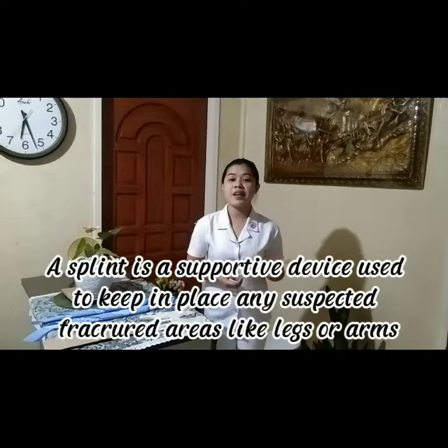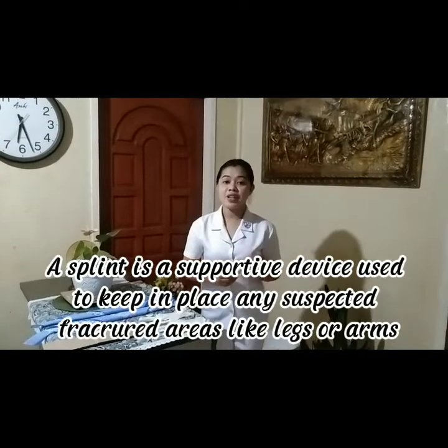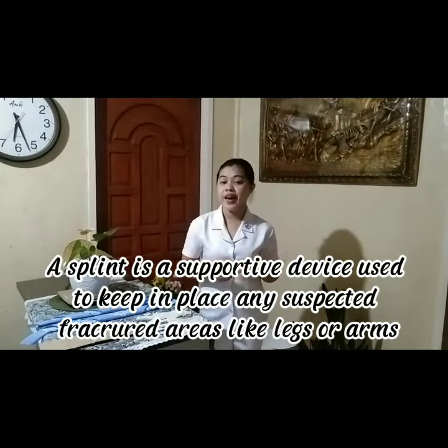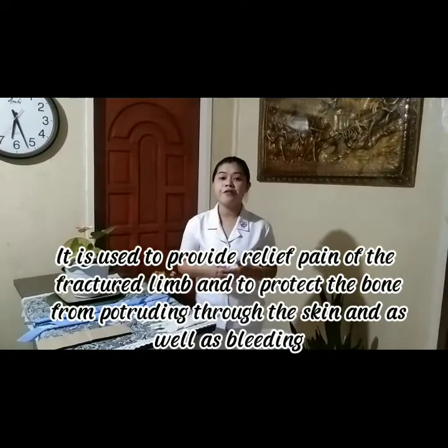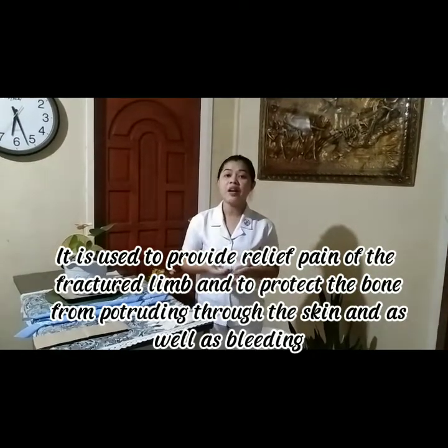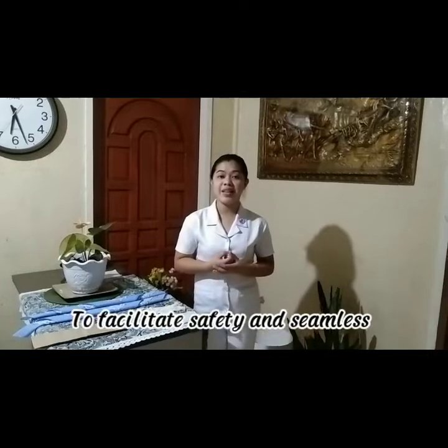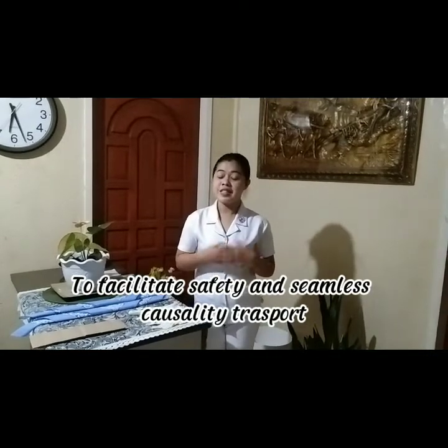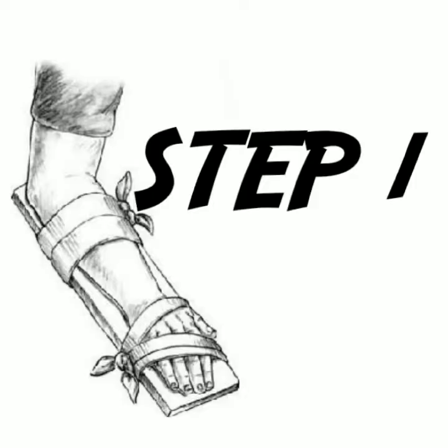But before that, I will tell you first what the purpose of applying a rigid splint is. A splint is a supportive device that is used to keep in place suspected fractured areas like legs or arms. It is also used to relieve pain of the fractured limbs and to protect the bone from protruding through the skin, as well as bleeding. Lastly, it is used to facilitate safety and seamless transport of casualties.